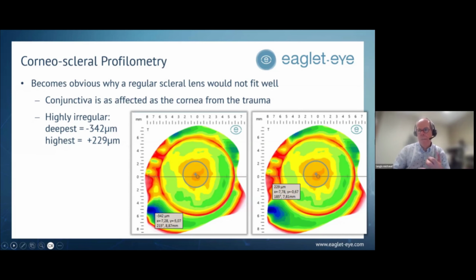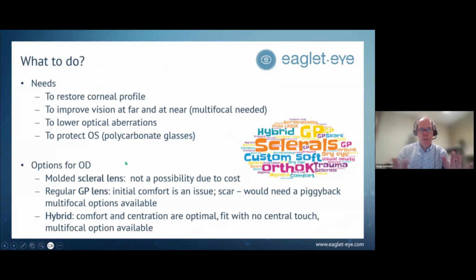Again, it saves my chair time, saves time of the patient, number of visits, and puts the expectations of the patients in perspective of what we can do to improve their condition. So it's very, very useful to scan prior to doing anything else. Not only when we face problems with devices, nowadays we use the profilometry as the first step to identify where the problems would be and what to expect from that particular surface. What can we do and what is possible to do with that kind of eye.